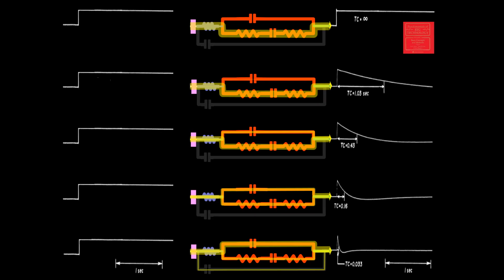Of all the metals and metal compounds so far studied and in commercial use, the one that will transmit more electricity through the resistive leg of the electrolyte-electrode interface is the one that will more closely reproduce a square wave. So as you can see, pointed by the arrow, the circuit with less resistance through the electrical double layer will reproduce a pulse of direct current best.